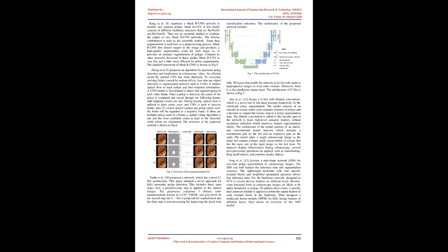Shin et al. 7 applied a region-based object detection scheme for polyp detection. Here they adopted the Region Proposal Network, RPN, which was introduced in the Faster RCNN method 24, to obtain a polyp candidate region in polyp frames. Then they applied a proper augmentation strategy such as rotating, scaling, shearing, blurring, and brightening. Then they applied two post-learning schemes, false positive learning and offline learning.